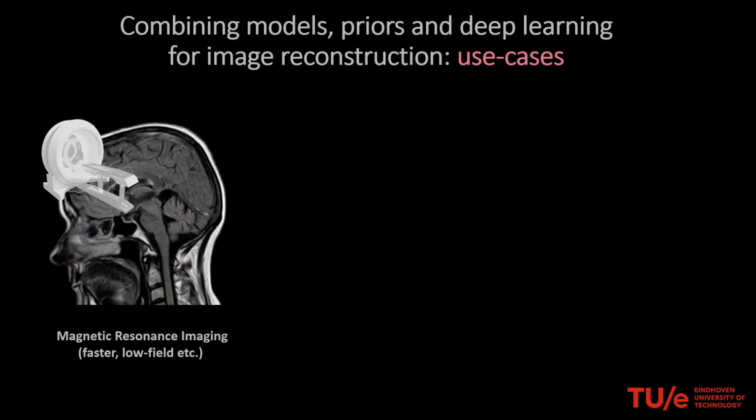Now moving on to a different application beyond ultrasound imaging, showing that these ideas are more generic than just for ultrasound. Let's look at a couple of things for MR. And in MR, we're going to look at actually another aspect of the same puzzle, which is to not just learn how to do good image reconstruction, but also to learn how to do good sampling. So to do the acquisition better, such that the image reconstruction can subsequently benefit from that, and we get the best possible image as an output.